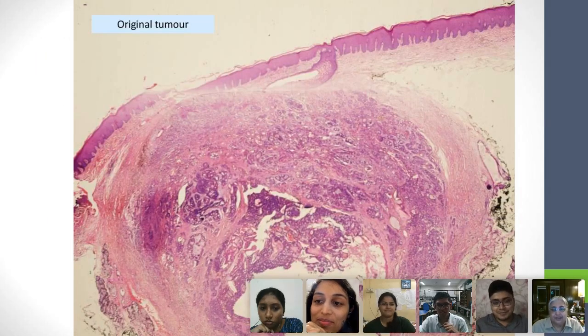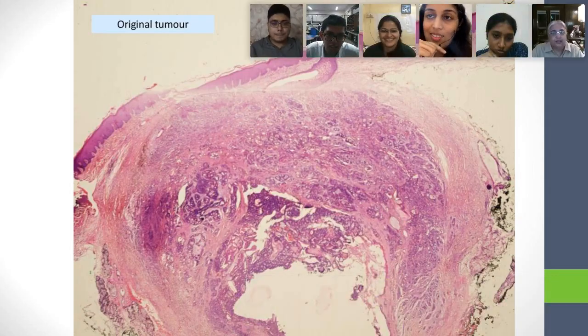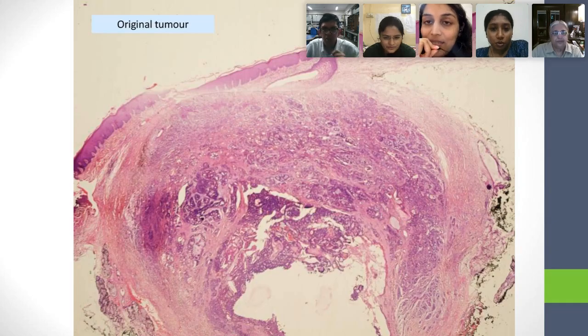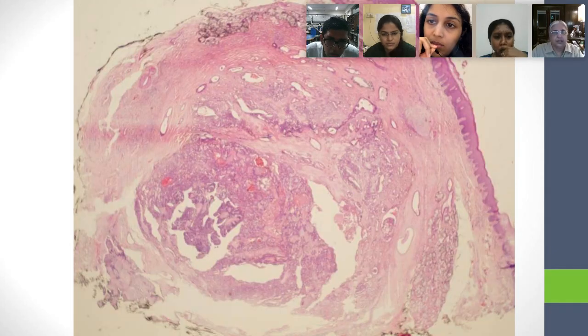Okay. Here is the original tumor. And you know, people say, nahi mil raha hai. But if you make enough efforts, there you are. It has come. This is the original tumor. Now, Ashish, what do you want to say about this original tumor? On this power, ma'am, there is reforming of the ducts that are seen. Reforming of ducts. Okay, let's see it at a little higher power.